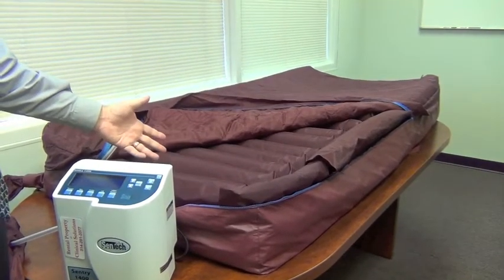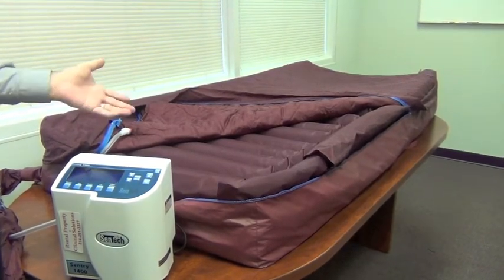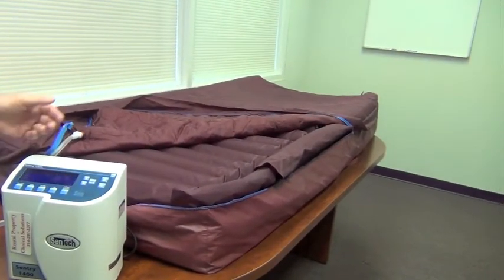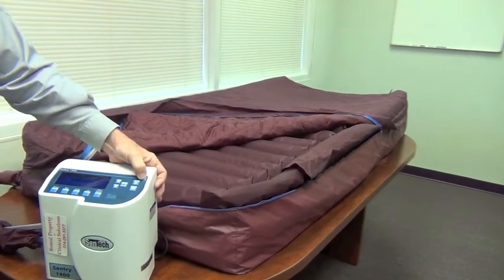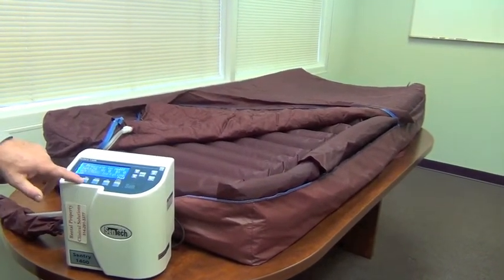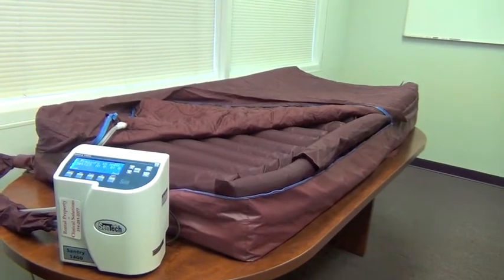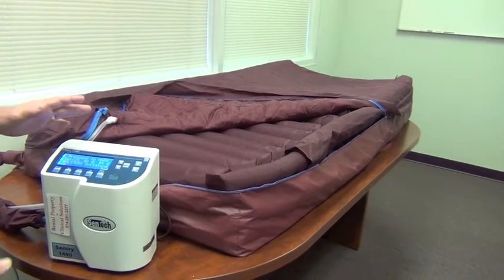So with the product deflated, bring the patient to a seated position, and you can do a pivotal transfer, you can do weight bearing, whatever is indicated. When you return the patient to bed, they're seated, swing them to a lying position, come down here, again, reconnect your air supply here on the side and power the unit up. You can allow it to fill passively, or if you want to hasten it, you can hit max and it will fill up a little more quickly. Remember, 30 minutes in max, it's going to kick out. So whatever therapy was set here is going to be maintained. That's something I want you all to understand.